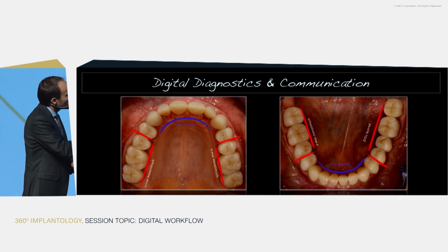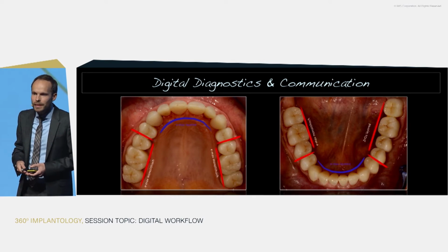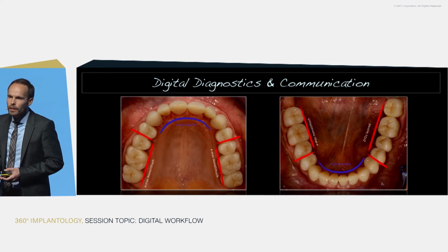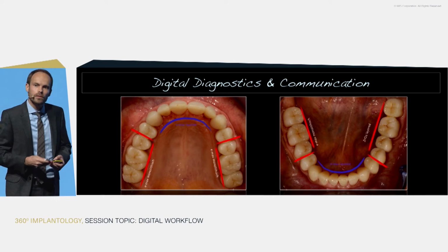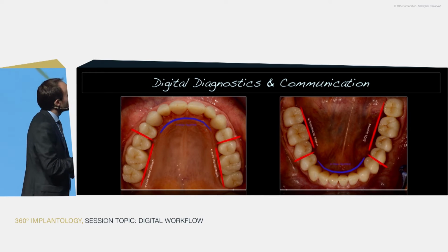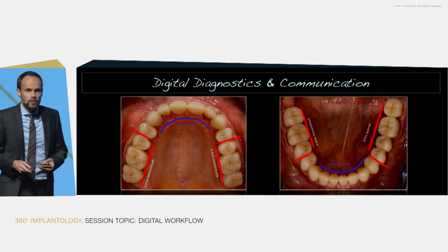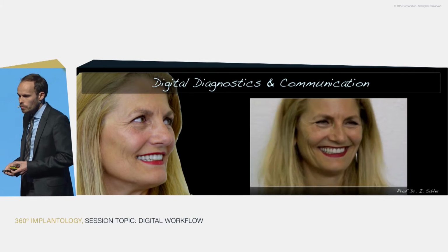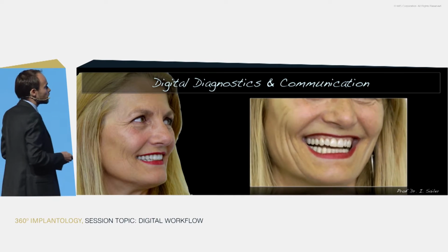The way we did it with single crowns in general is we try to be as monolithic as possible in the posterior zone, and in the anterior zone to have all the benefit of the aesthetic, all the benefit of the surface texture, of the layering, of the beauty of the ceramic. We will veneer very small and slightly only the buccal aspect of the anterior zone. And you can see her here smiling, the final result. And I think we achieved quite a nice result.